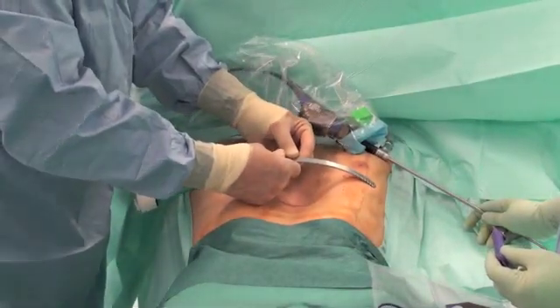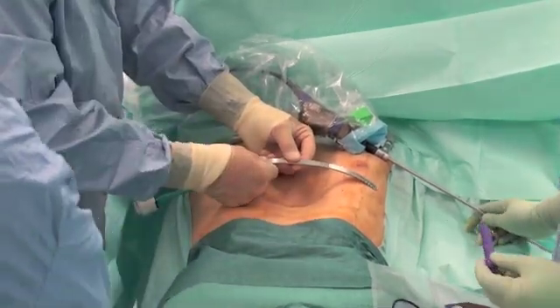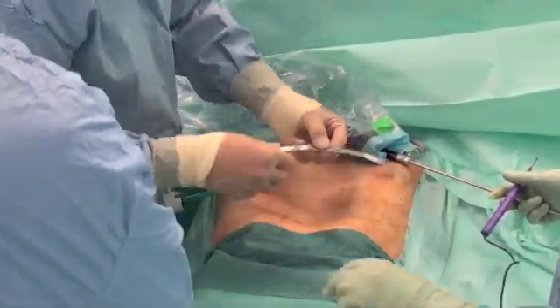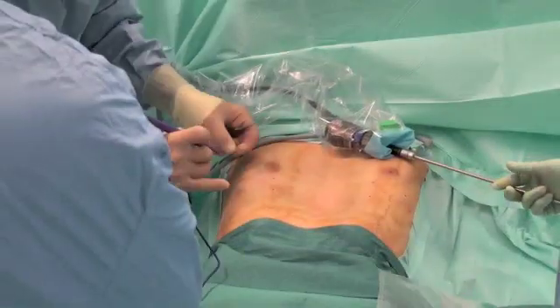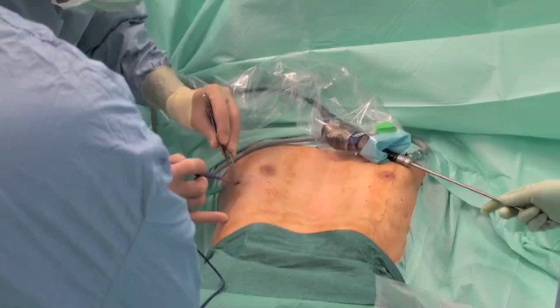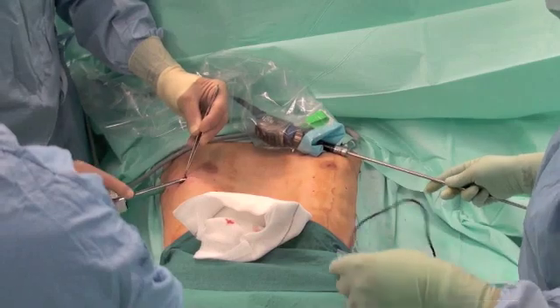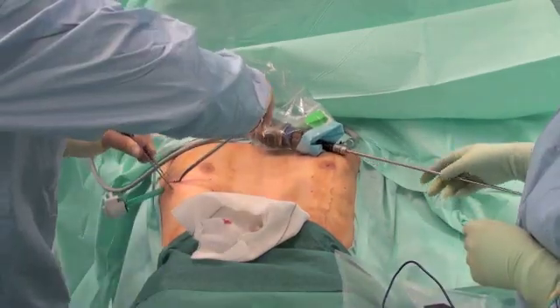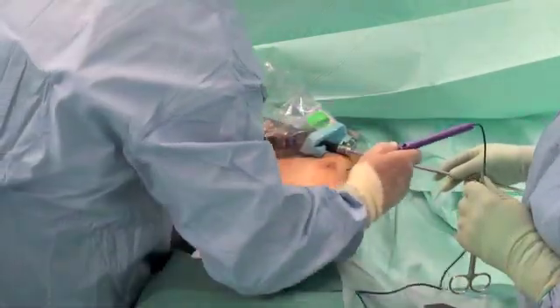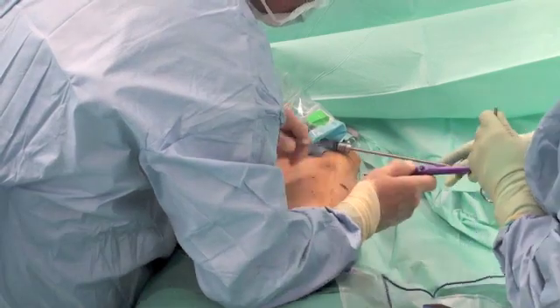Then we do a final check on the patient. We also place a dot at the end of each side which marks where our skin incisions are going to be, ensuring that they are in the perfect position. This is the first incision on the right hand side of the patient. It is superficial to the muscle, so Professor Peeligard is just making a pocket outside of the muscle. If you were to go above the nipple, you would go under the pectoral muscles.